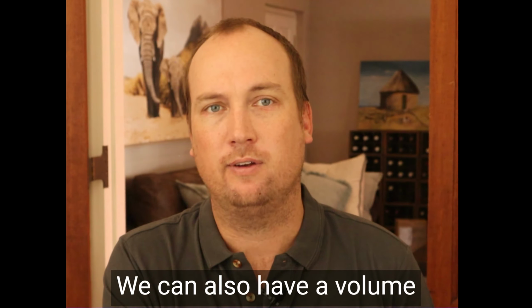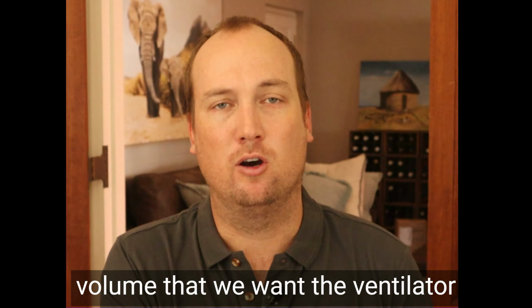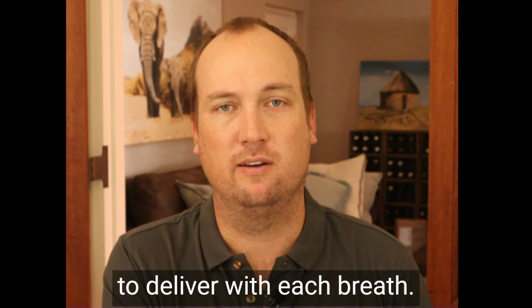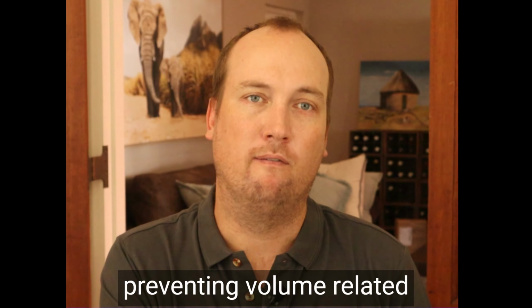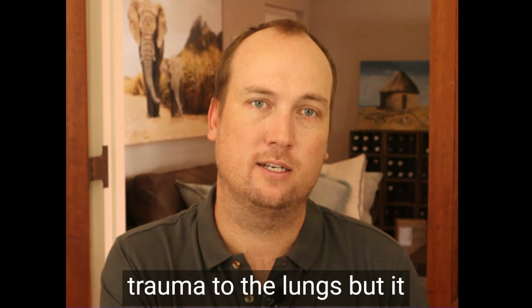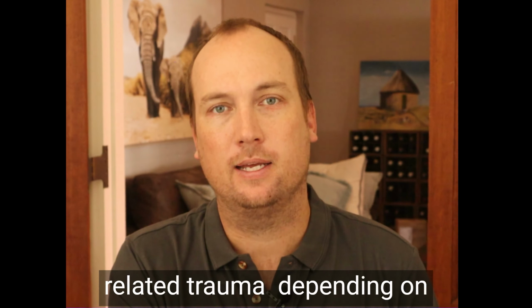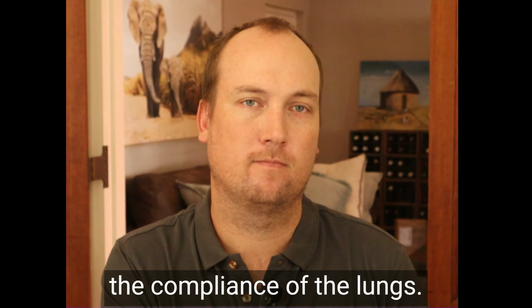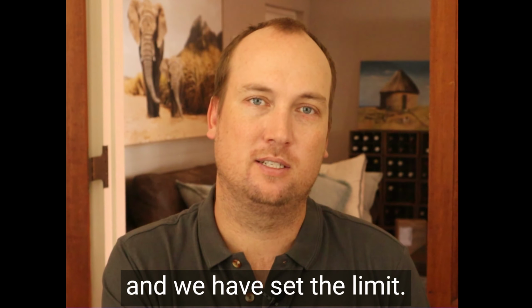We can also have a volume-limited breath where we set the volume that we want the ventilator to deliver with each breath, and this has the benefit of preventing volume-related trauma to the lungs, but it may still result in pressure-related trauma depending on the compliance of the lungs. So we have set the trigger and we have set the limit.